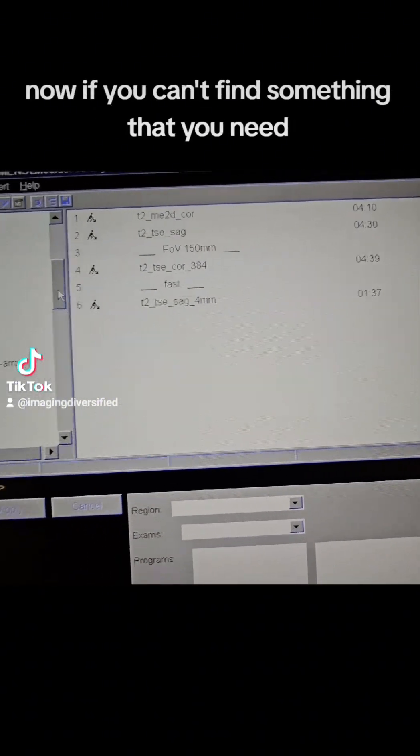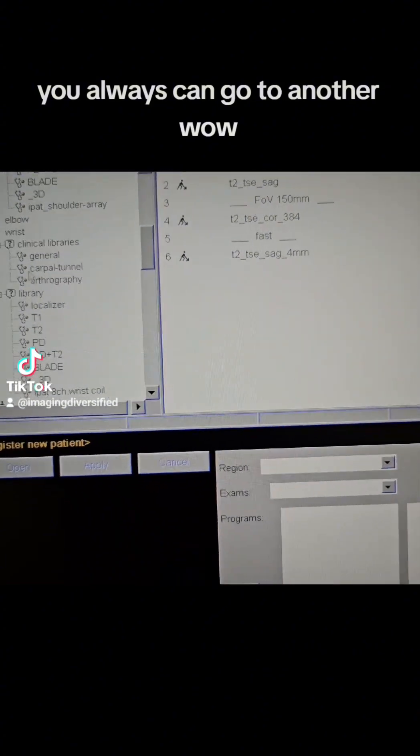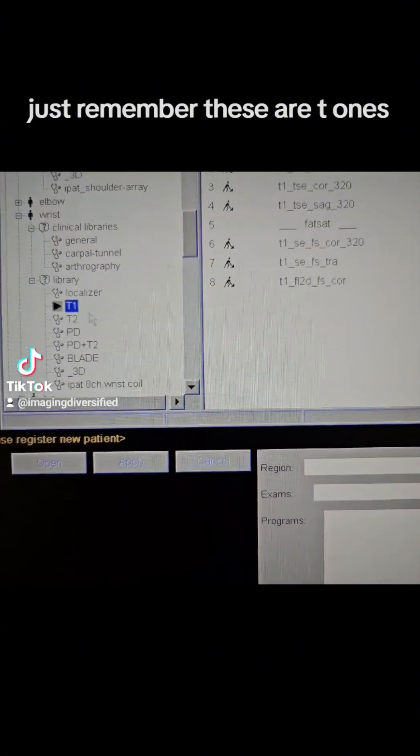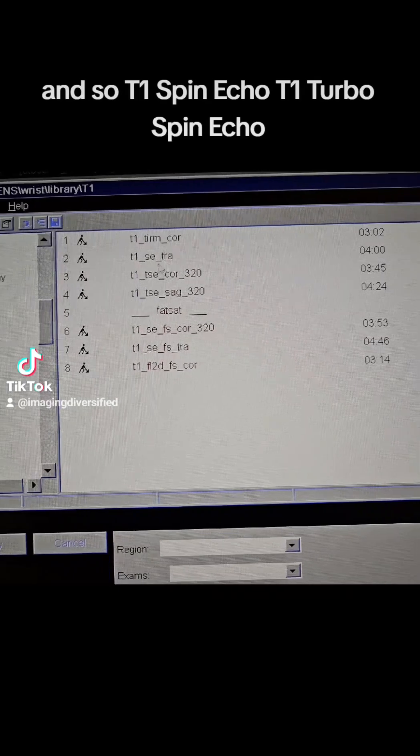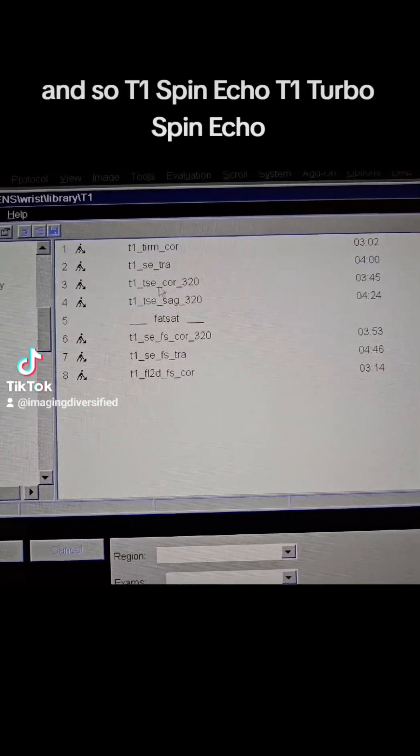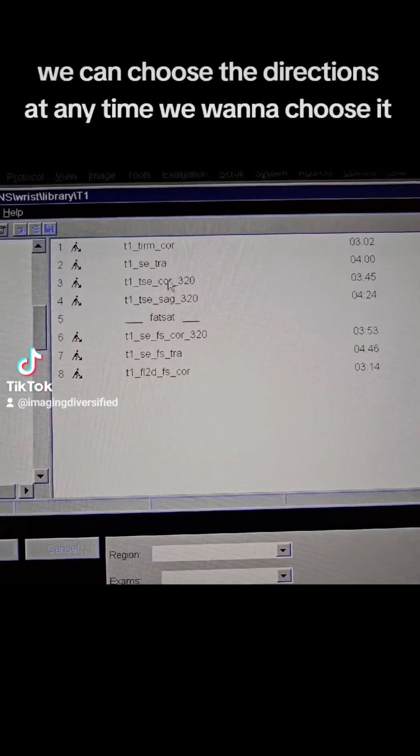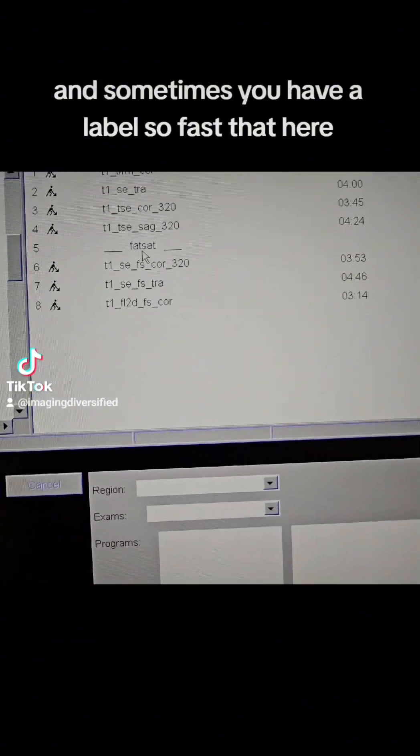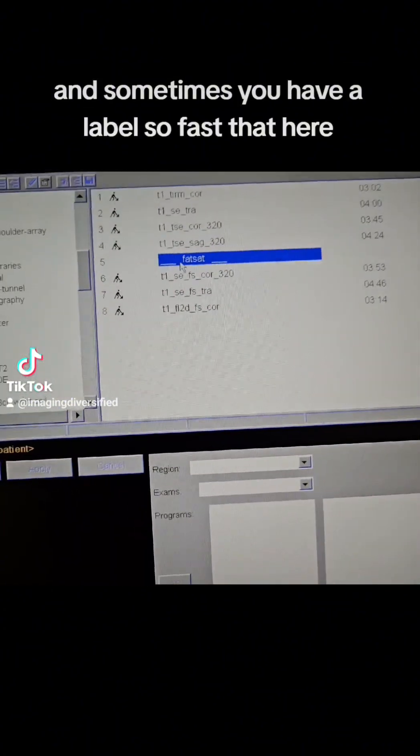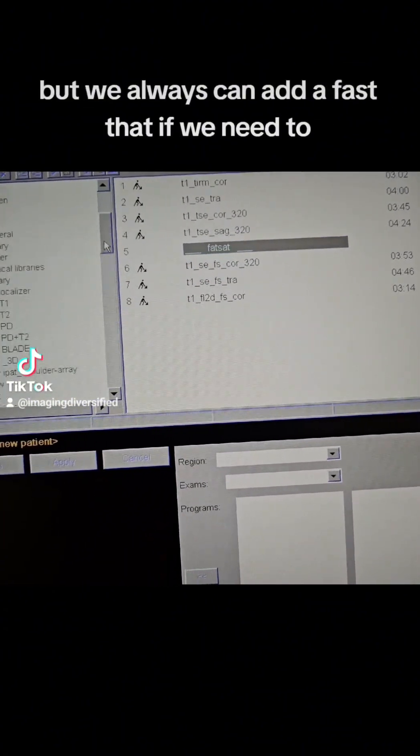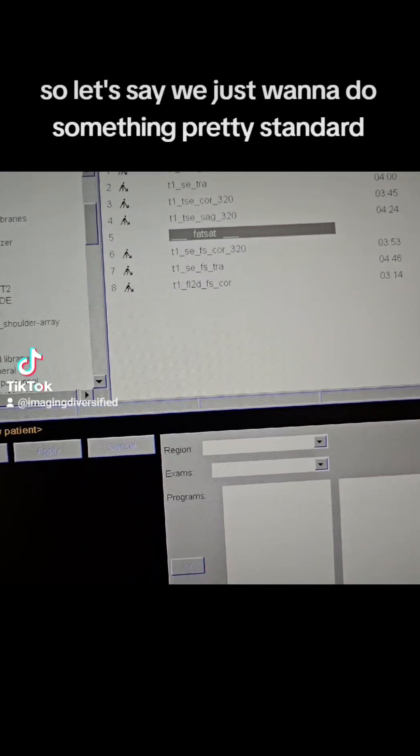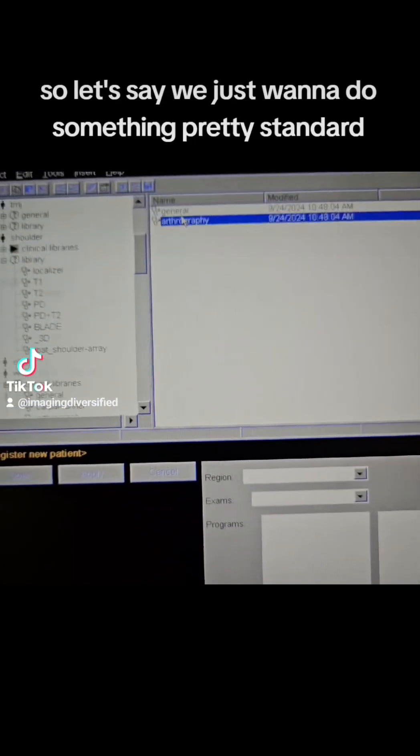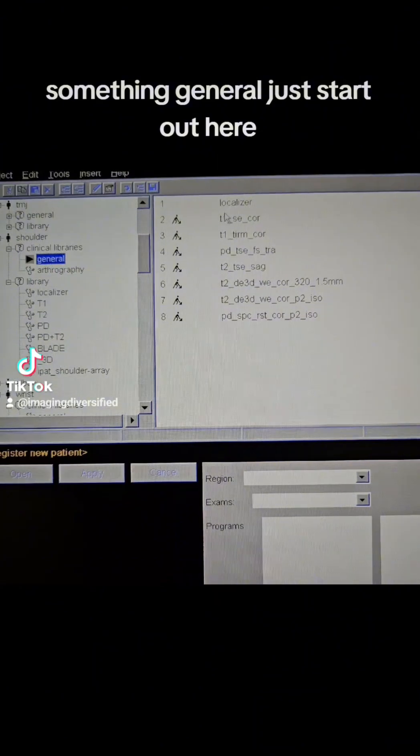Now if you can't find something that you need, you always can go to another file. Just remember, these are T1s, T1 Spin Echo, T1 Turbo Spin Echo. We can choose the directions at any time we want to choose it, and sometimes you'll have a label that says FATSAT here, but we always can add a FATSAT if we need to. So let's say we just want to do something pretty standard, something general, just to start out here.